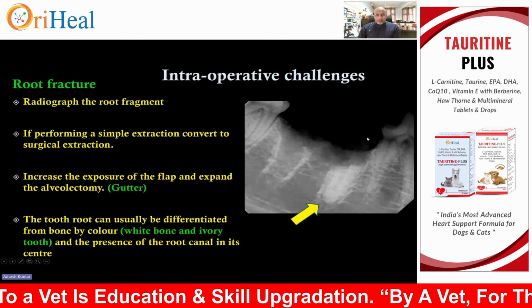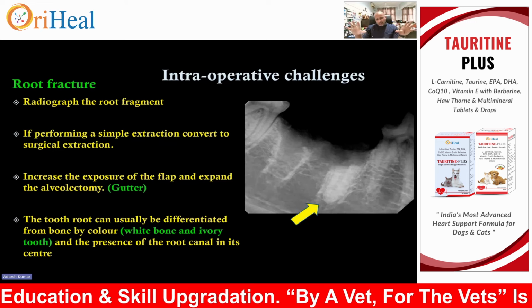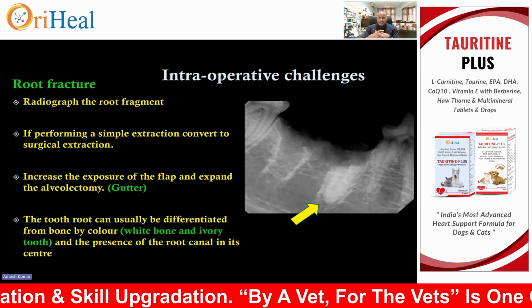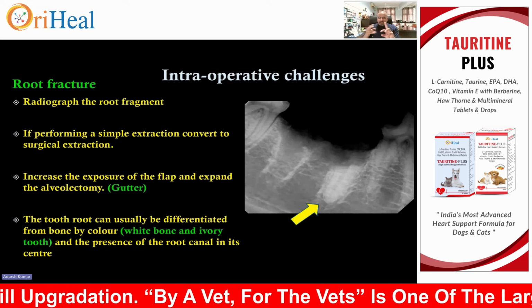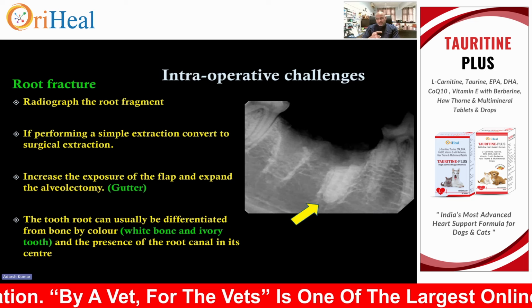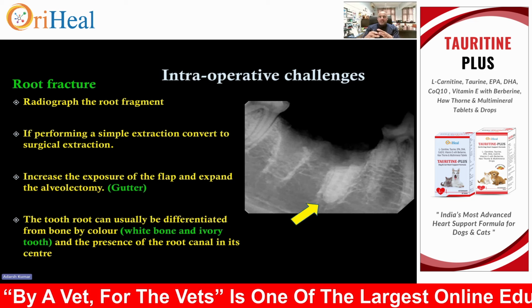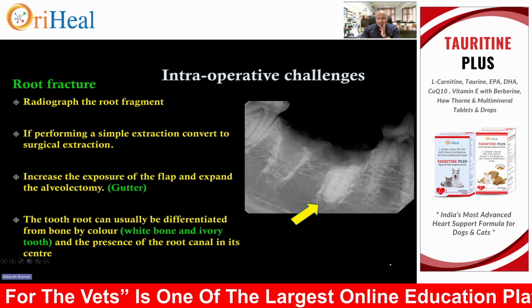Now this is regarding the extractions of the tooth. The principle is one: single root tooth, no sectioning; two roots, section it; three roots, section it. All the roots are to be taken out separately. Now, can you see this X-ray? There can be some intraoperative challenges here.